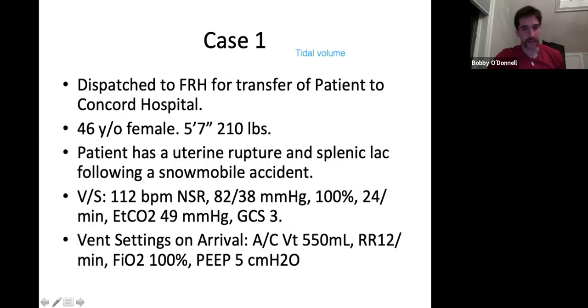So they're really hypotensive, right? That's an issue off the bat, and they're on a propofol infusion. The vent rate is set to 12, but they're breathing at 24, so they're over-breathing the vent. They're tachycardic. Their FiO2 is at 100, and they've been intubated for an hour.